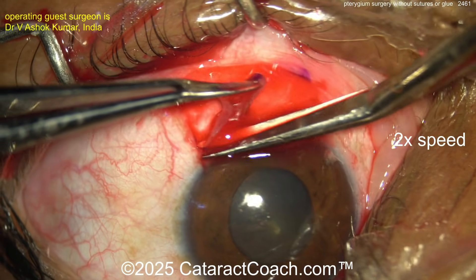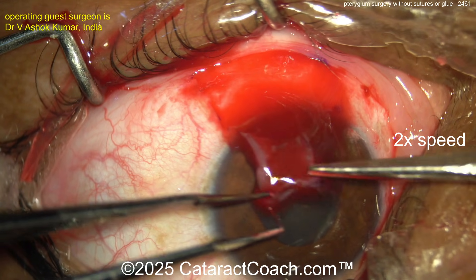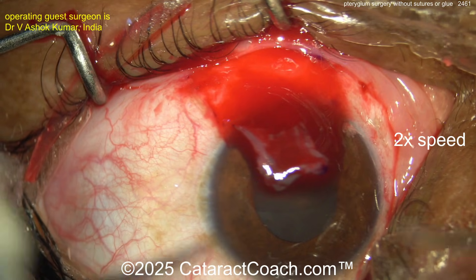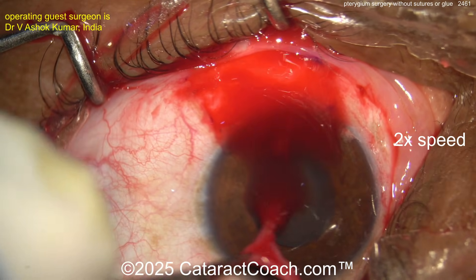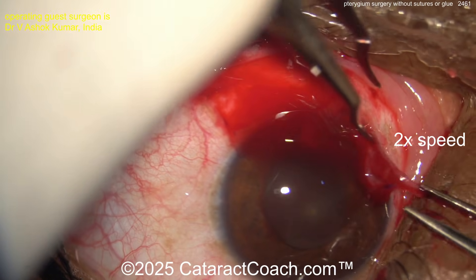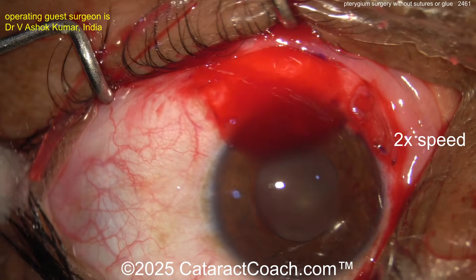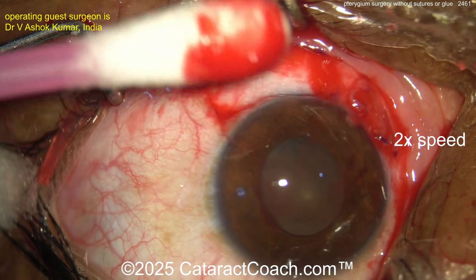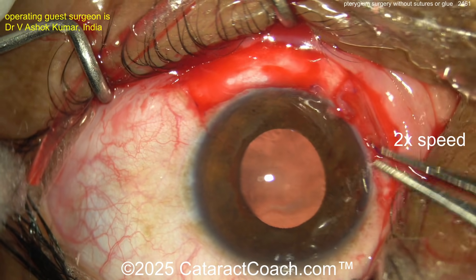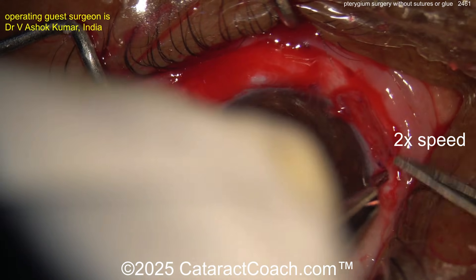Now transposing the graft — back upside down on the cornea, keeping orientation correct, very important. Grabbing both ends and flipping it the correct way, then slowly spreading it out. The patient's own blood is going to cause it to stick in place. We had a similar video from Pradeep Mohanta on Cataract Coach doing pterygium the same way — no sutures, no glue, just using the patient's own blood.